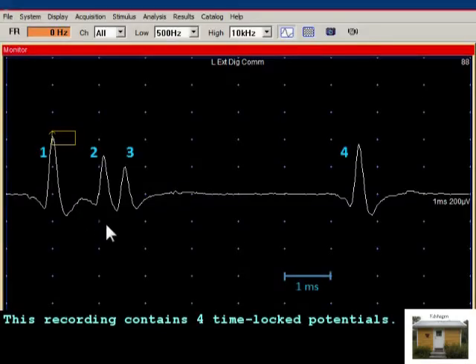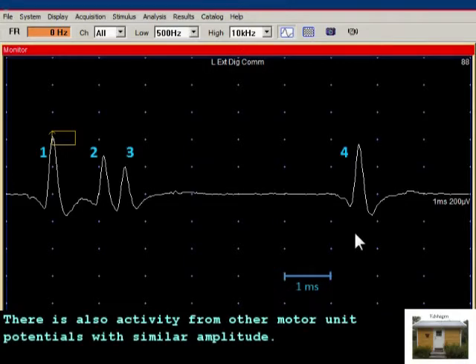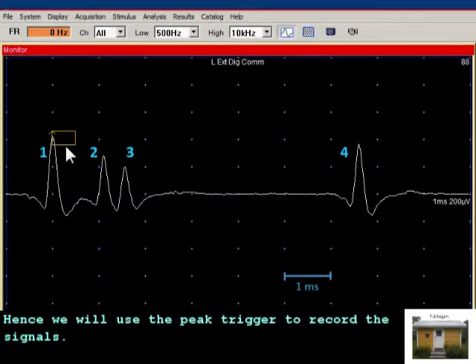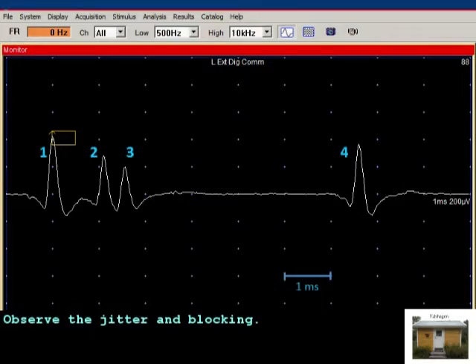This recording contains four time-blocked potentials. There is also activity from other motor unit potentials with similar amplitude, and hence we will use the peak trigger to record the signals. Observe the jitter and blocking.